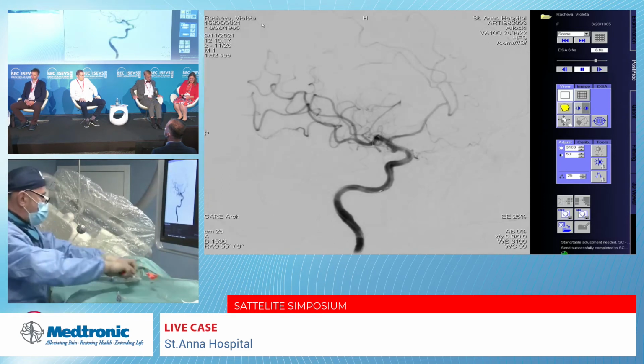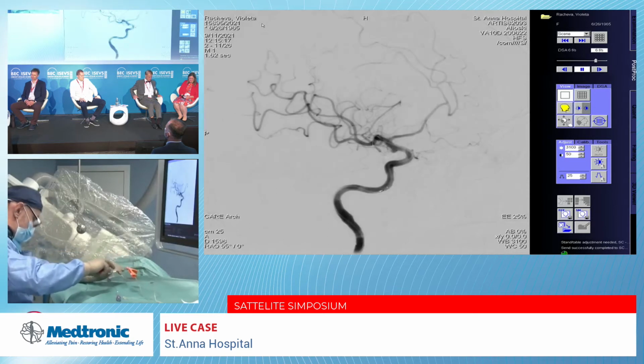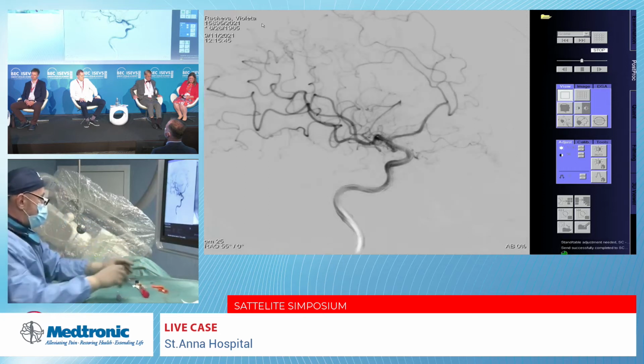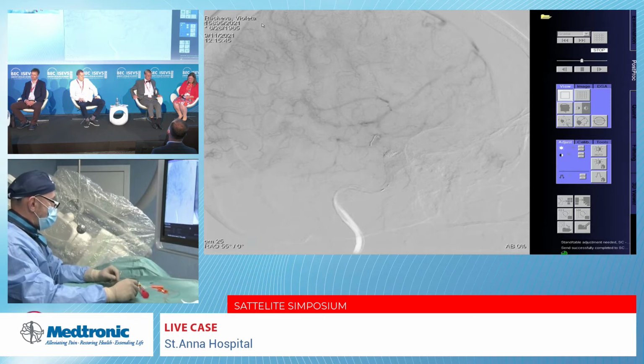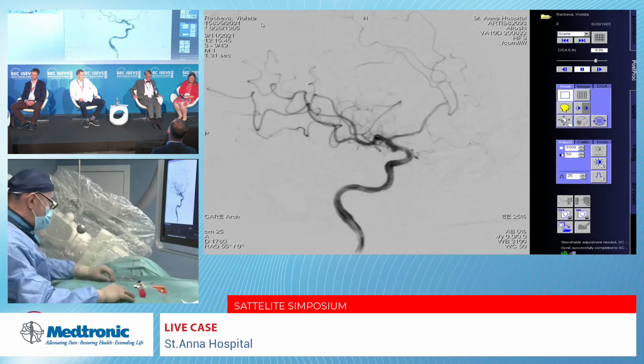Now, I will wait for the venous phase to see the stagnation of the contrast in the aneurysm. Yeah, good demonstration. I go out.